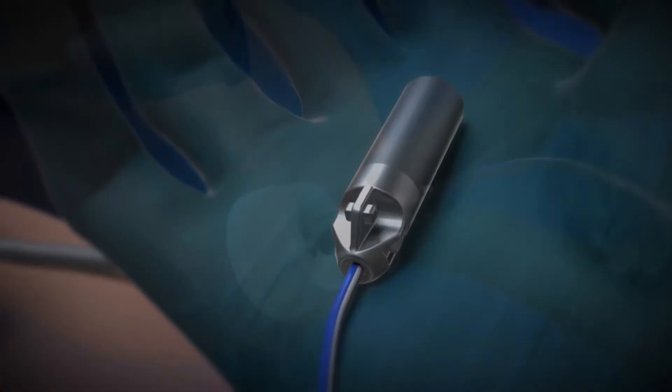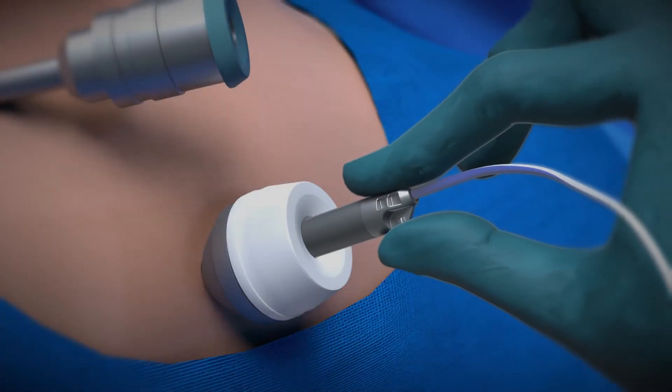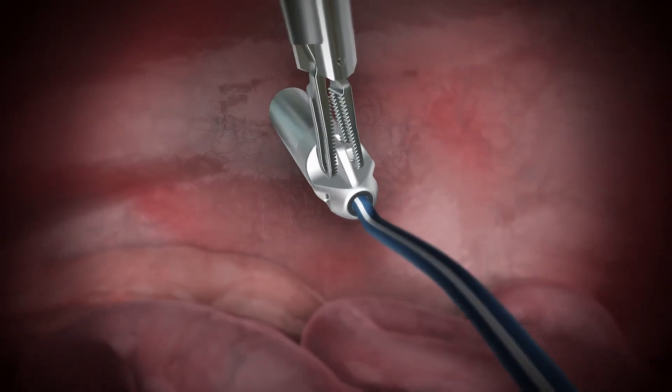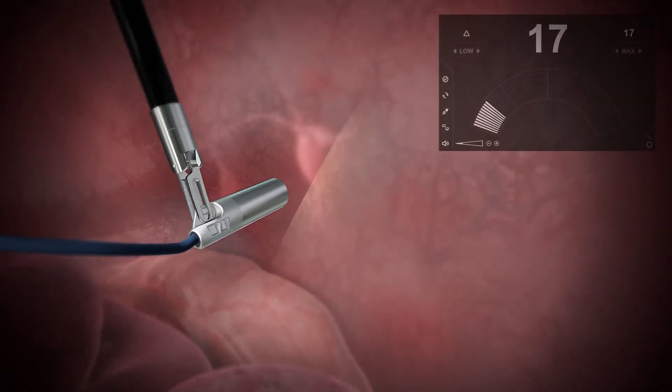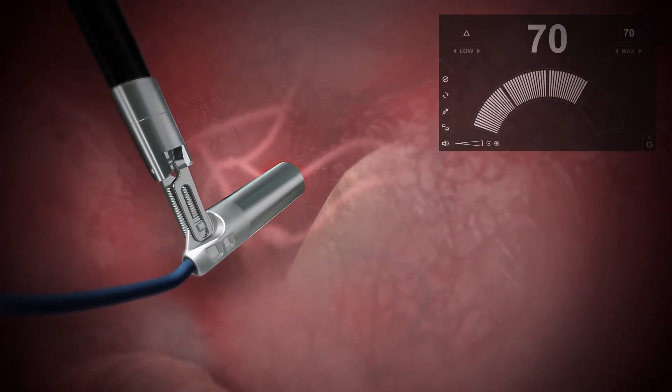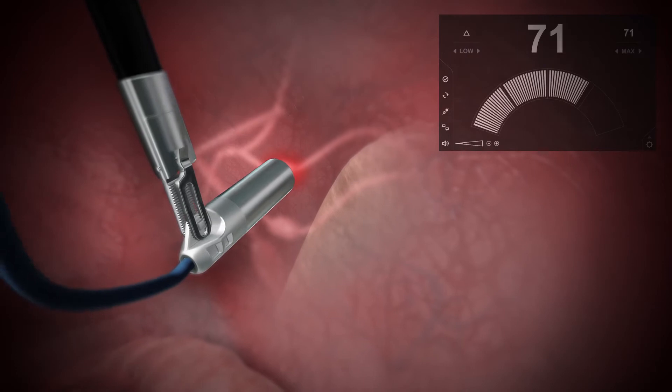Sensei is then inserted into the patient using a standard laparoscopic port and maneuvered by tissue graspers to scan inside the patient. When scanning tissue, the console provides audio feedback to the surgeon. This feedback helps the surgeon to locate specifically where the cancer is in real time.